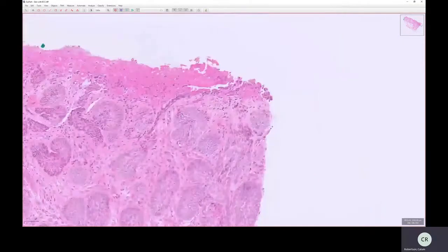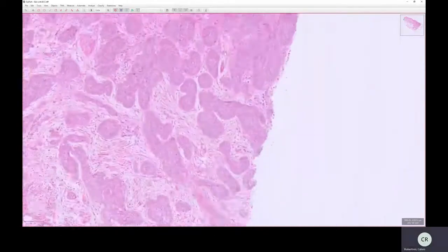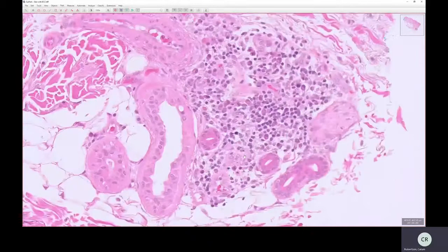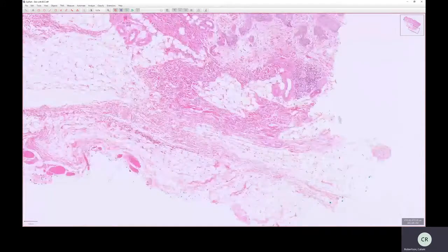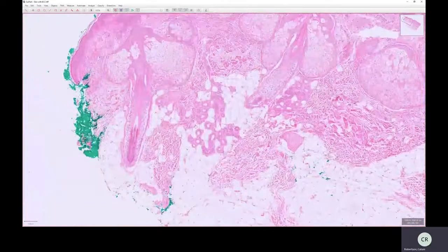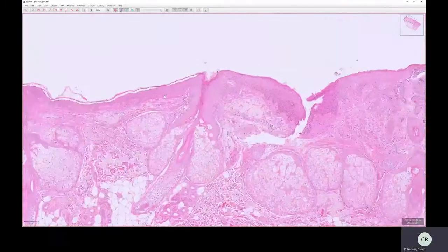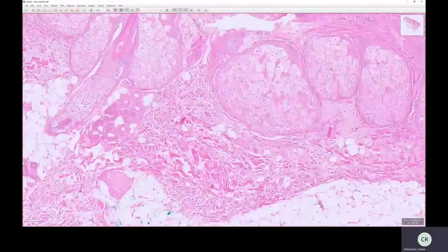The other main inflammatory cell is a macrophage. So a macrophage is a big eater. Basically, that's what the name means. It's part of the antigen presenting system. So they gobble up antigens and present them to your other cells, your lymphocytes, for example, and your other immune cells. So I'm trying to find a macrophage.